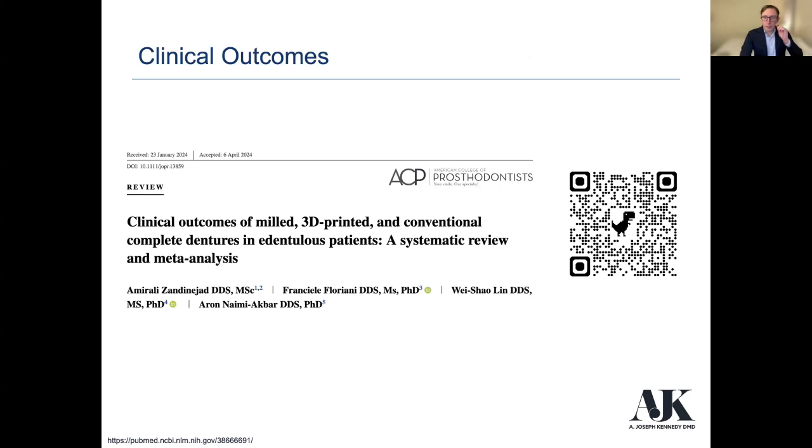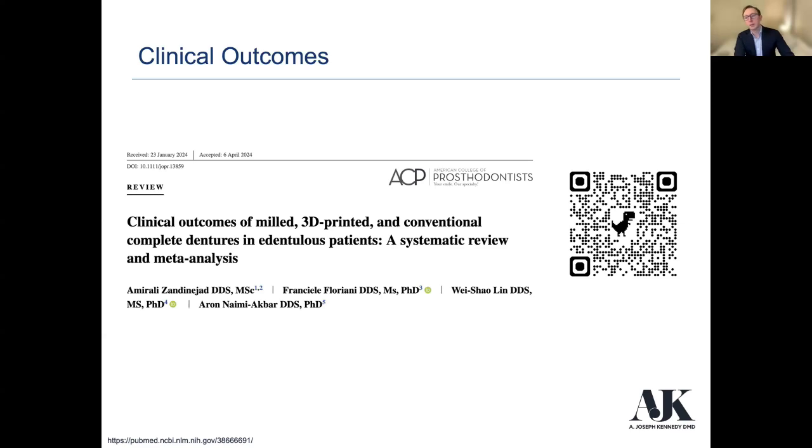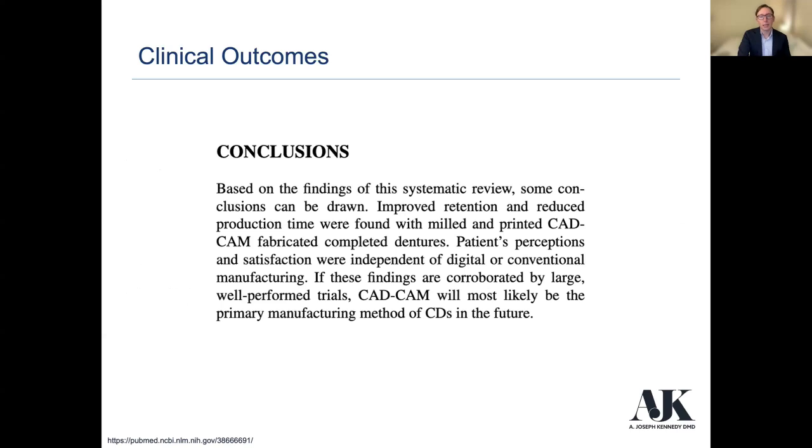So let's take a look at another study here. We've got clinical outcomes of milled, 3D printed, and conventional complete dentures in these patients. And this is a nice systematic review from early 2024, the ACP. And again, I implore you to look into this. I don't have the time tonight to go in depth on each one of these studies here, but the takeaway here is that improved retention and reduced production time were found in both milled and printed fabricated dentures, which again, I think is kind of the future here.